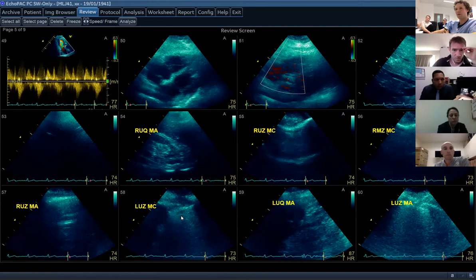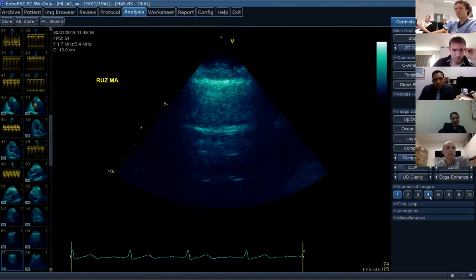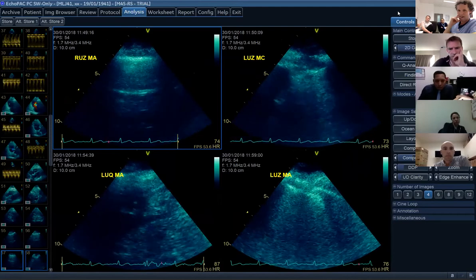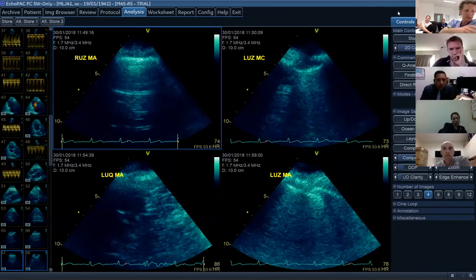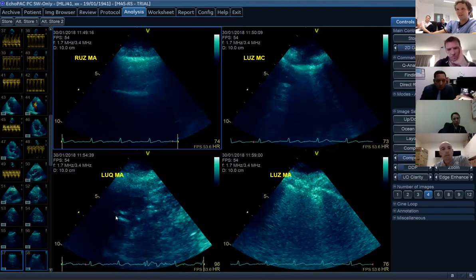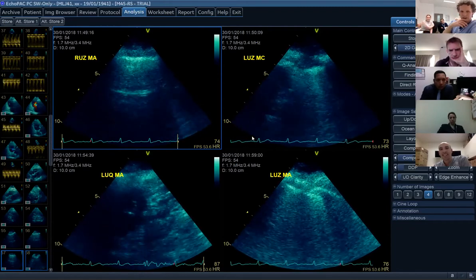lung ultrasound. So let me give you... Let's try this. So I'm going to say that on the X-ray though, the left diaphragm looks high. So this guy's on pressure support ventilation, so he's breathing spontaneously, okay? They're a bit dodgy, but you get the idea that the bottom left is the left upper quadrant. And then, yeah, let's just start with that. What are you seeing on this?